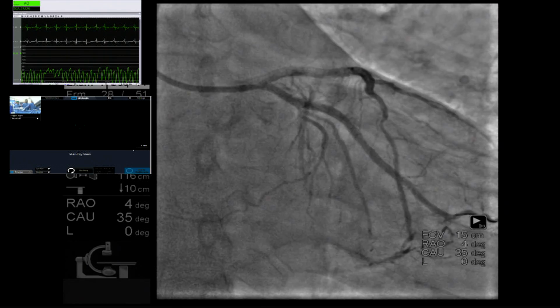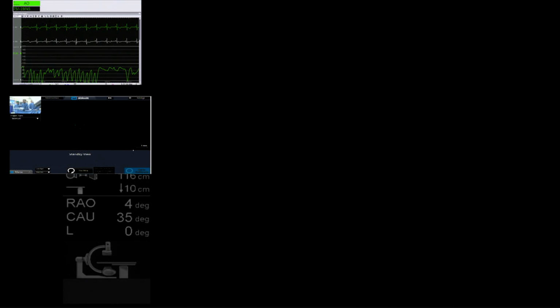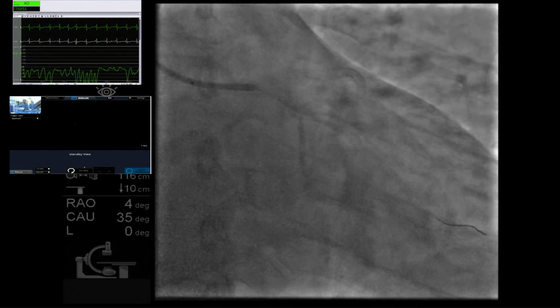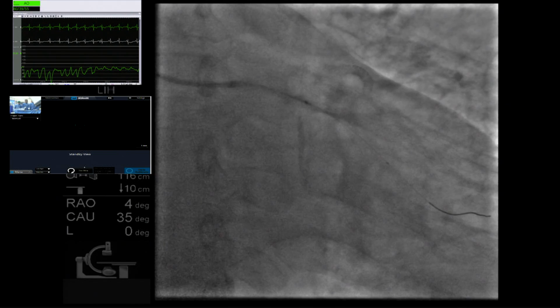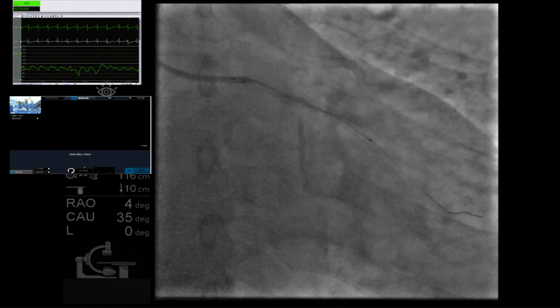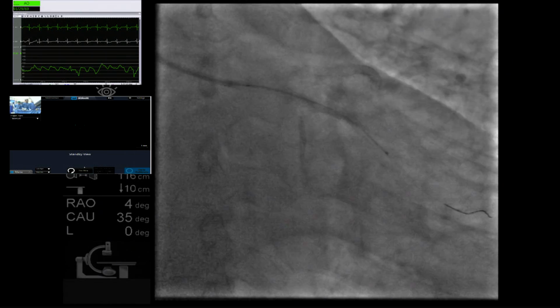Mauricio, can I ask you a question? Dr. Akasaka, if you look at the literature, and you've written, there are many definitions of stent expansion. What's your preferred definition of stent expansion? Prospectively, before we do this study here. I think percent diameter stenosis is more... We're in good shape, 90% expansion. I agree, but it depends on the case.